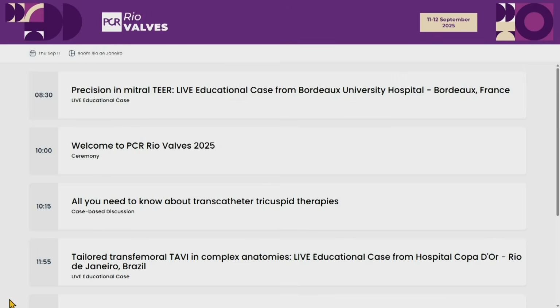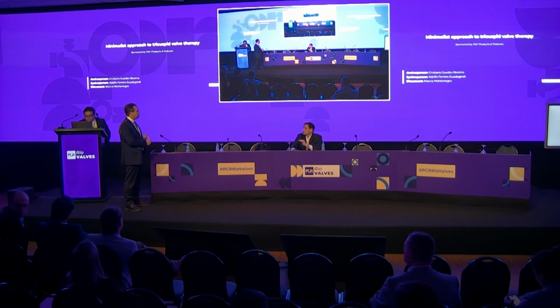Very sick patient, local anesthesia, sedation, mild sedation, transthoracic echo, no contrast, and a procedure that we will show in a few minutes here in this place. It's absolutely like this. You can guide the procedure.